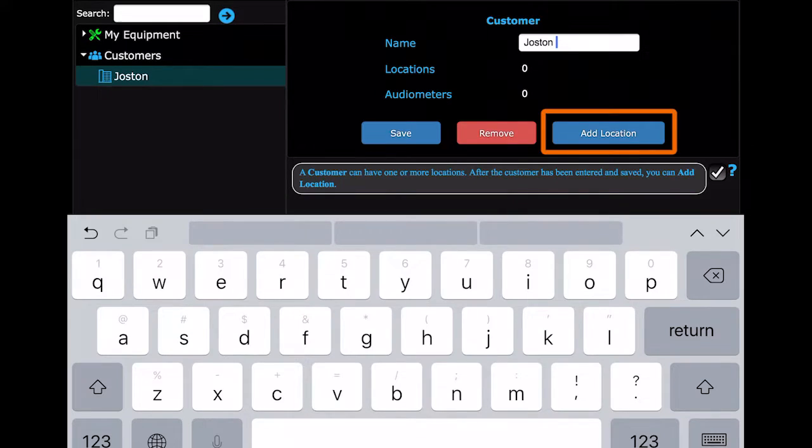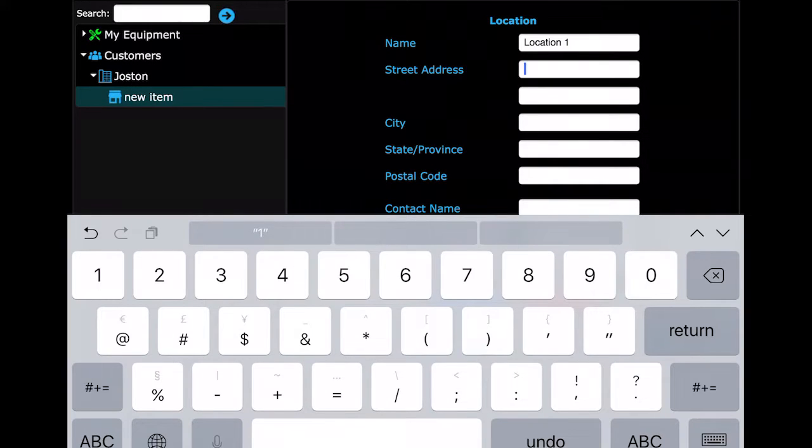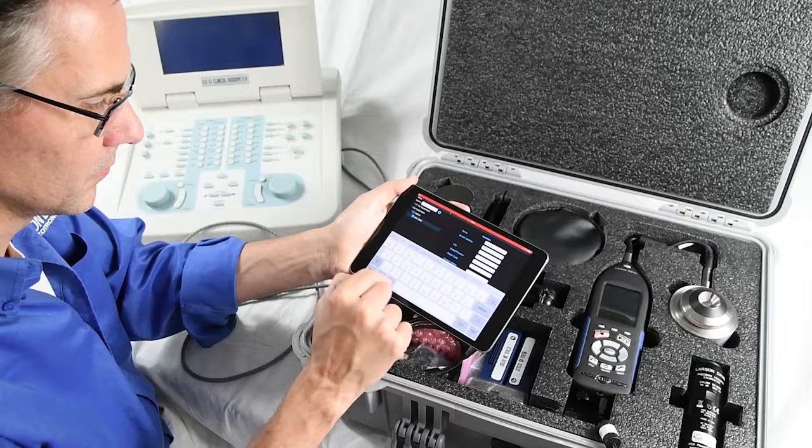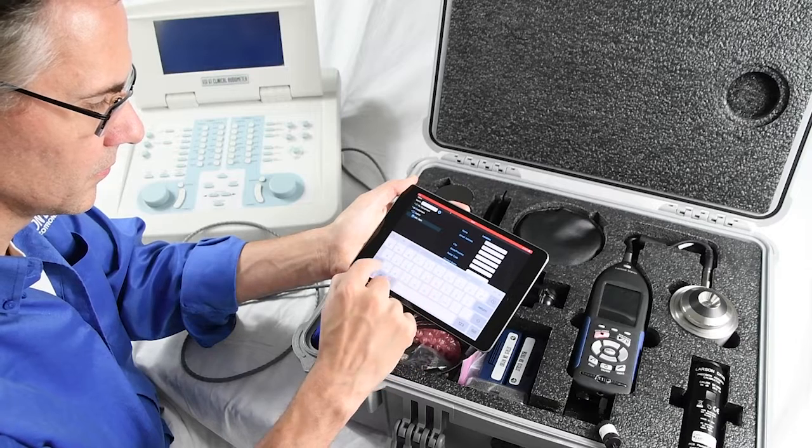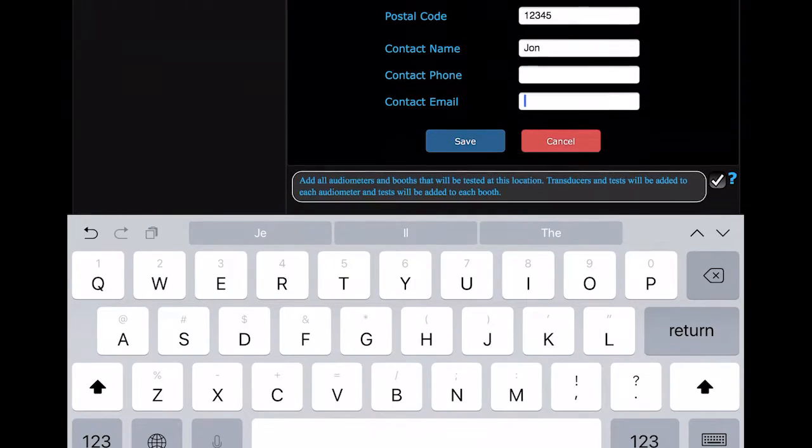Now the button for Add Location appears. Select it and add the location information. This is the location that the audiometer or booth is located, not the mailing address or any other address. Enter contact information for your customer and then Save.